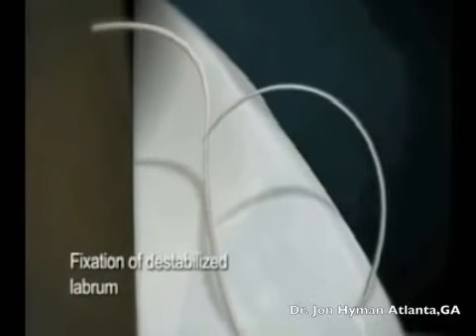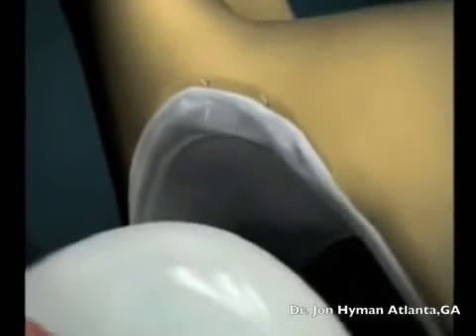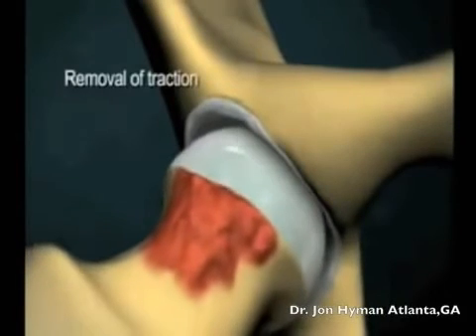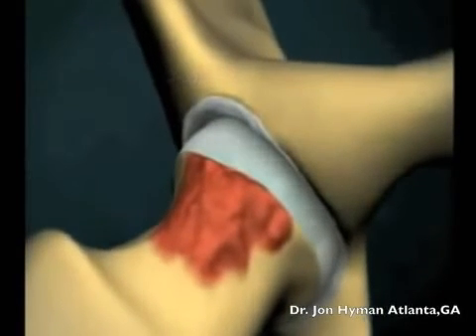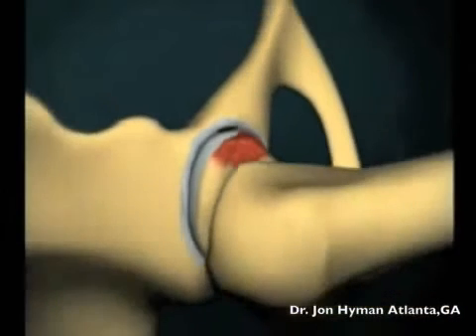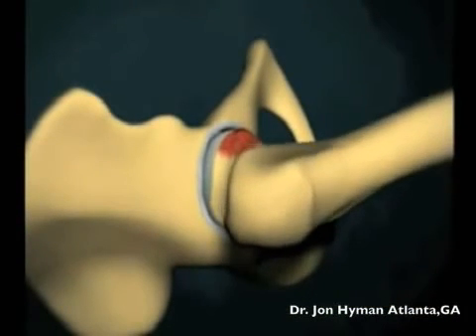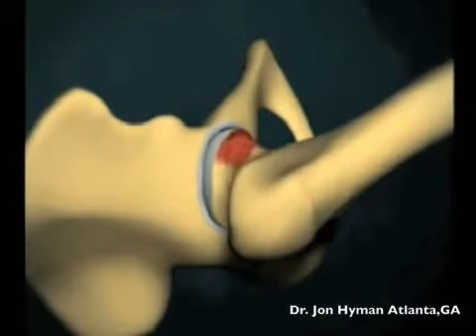After the labrum is refixed, the traction is released and the femoral head is brought back into the acetabulum. The hip is flexed to approximately 30 degrees. This relaxes the capsule and helps to fully visualize the cam lesion in the periphery of the joint.